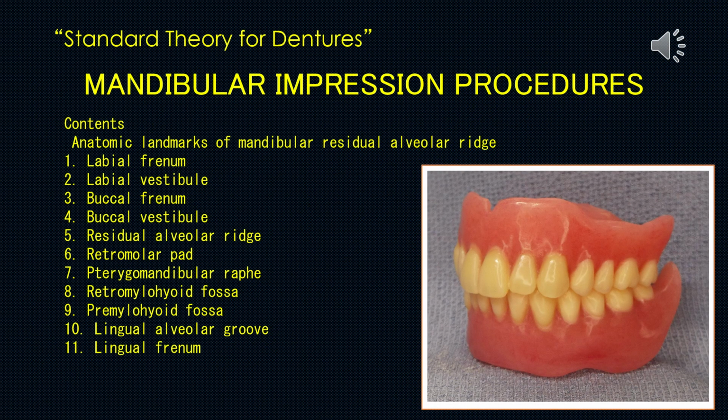Standard Theory for Dentures. I am Sotokawa, a dentist practicing in Morioka City, Japan. This topic covers the mandibular impression procedures.